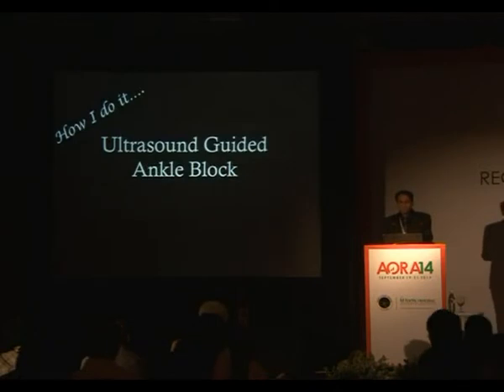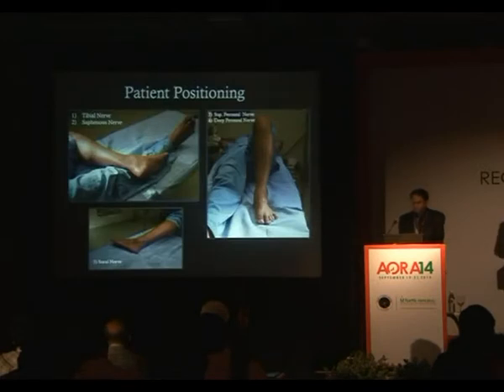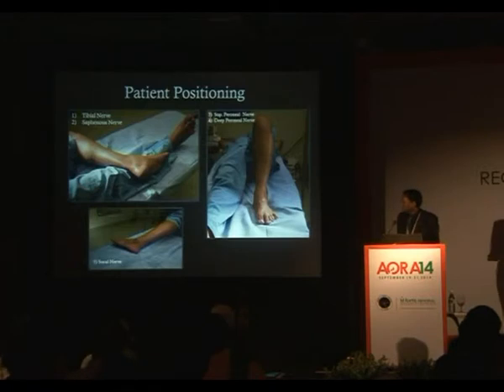So very quickly, I'm just going to tell you how I do it. I'm not going to get too much into the details of anatomy. Obviously, it's going to be with ultrasound. Right now, remember there are 5 nerves to be blocked, so the patient actually tosses around on the table quite a bit. To block the tibial and the saphenous nerve, I like to keep my patient this way, with his legs crossed over onto the other leg. There's a reason for it.